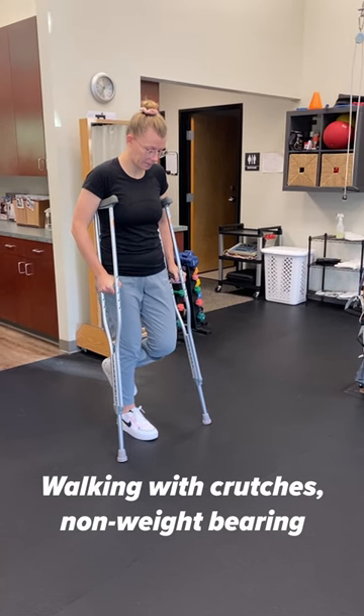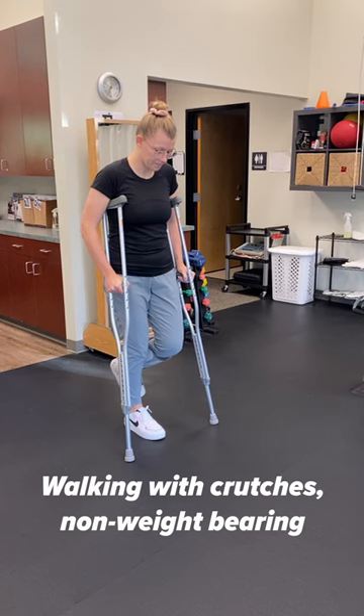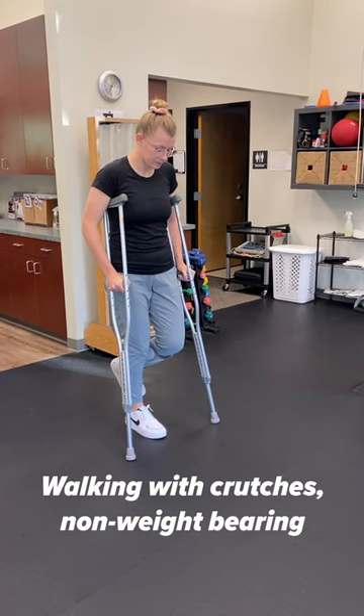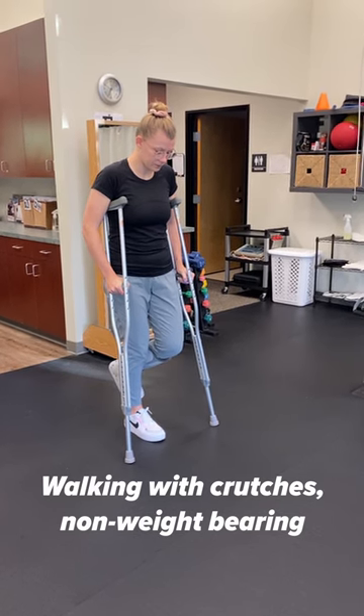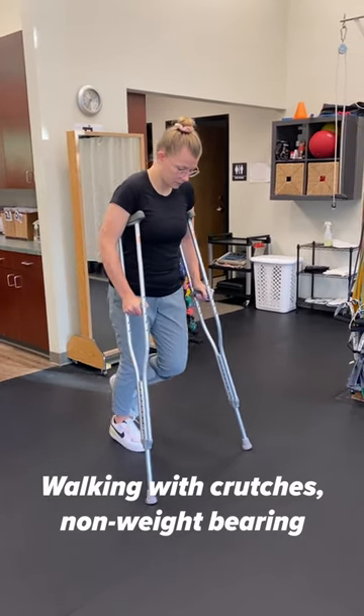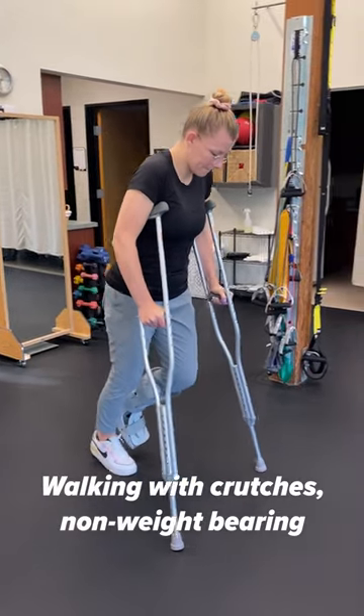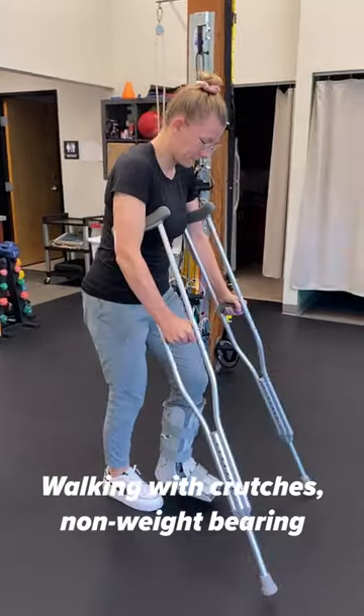In the non-weight-bearing phase, you're not going to be able to put weight through your injured leg. How you're going to walk is you're going to basically advance the crutches forward, then transfer weight through your arms, and then transfer — almost like a small hop.